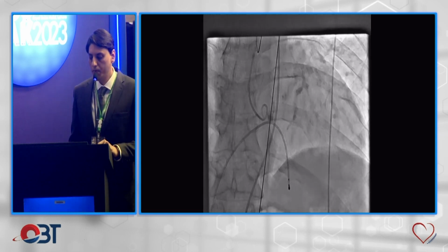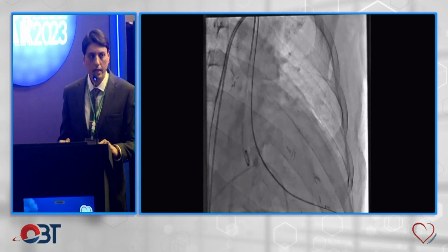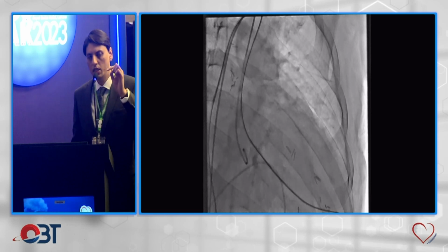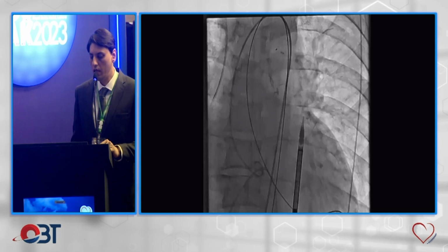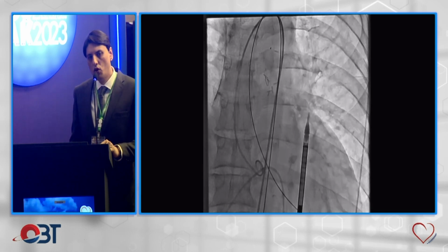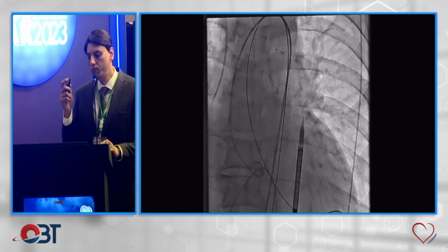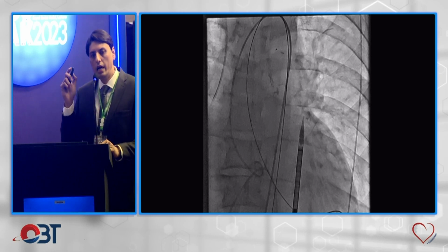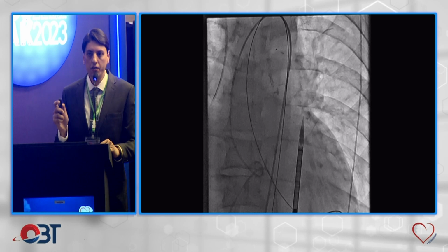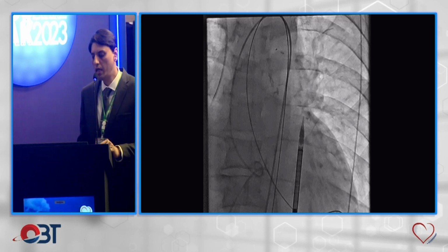This is the cusp overlap, coplanar view, and then we cross the LV with a straight tip wire, with the AL1 with the straight tip, and then exchange it with the Lunderquist wire. Before pre-dilation, that is a norm that we always check for the valve, adequate loading of the valve, because in this case, the patient might go into severe AI, so we should be ready with our valve so that it can be deployed relatively quickly.